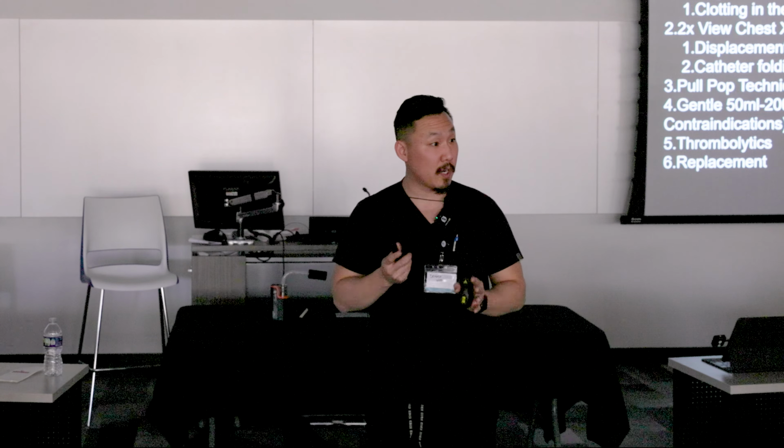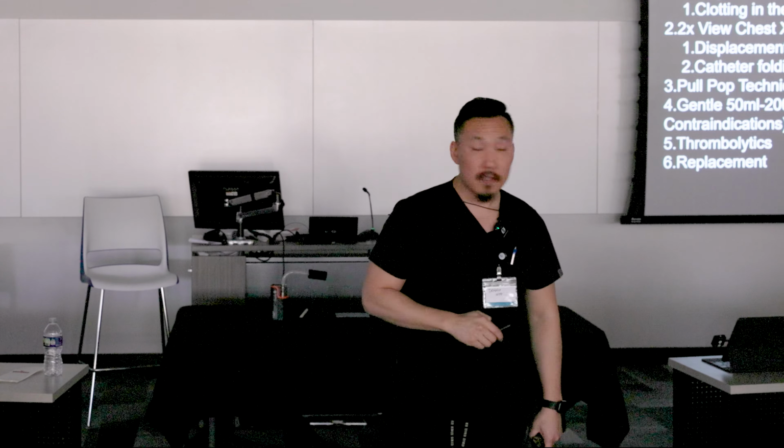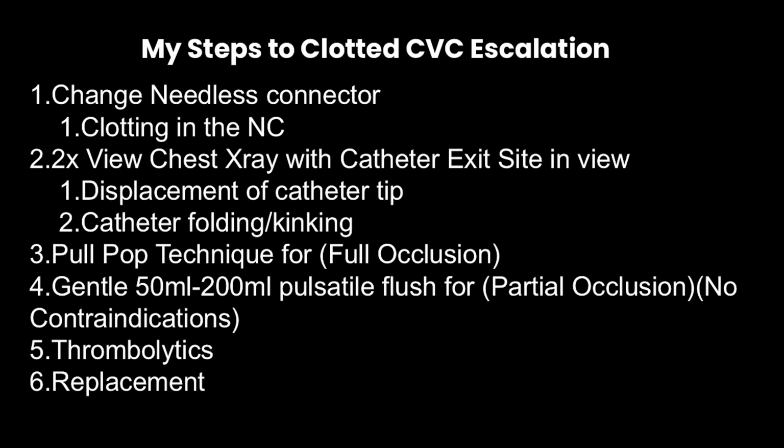I've seen x-rays where we did the 2-view and we saw that it was dipped in. I was like, oh, that makes sense. That's why. Okay. Now, displacement of the catheter tip, catheter folding and kinking, pull pop technique. This is controversial, but I have studies to back it up. At the end of the presentation, all my references of everything I'm talking about is in there. They did a study in 2020, I believe, that recently published to show the efficacy of this.